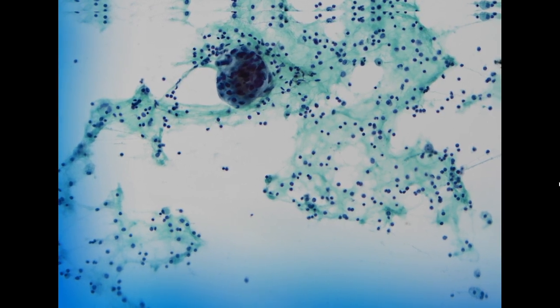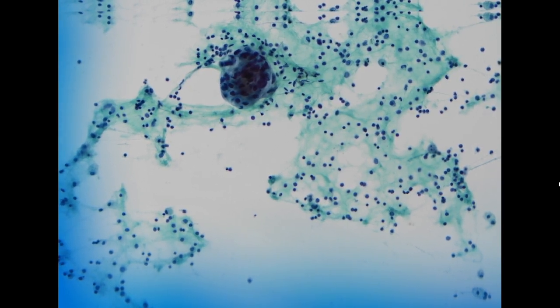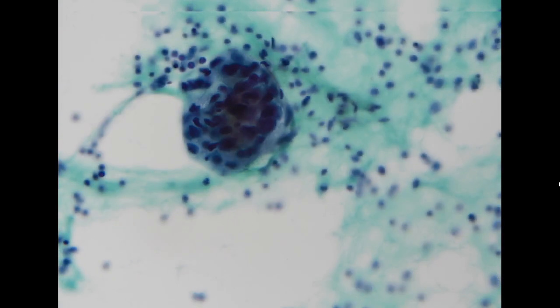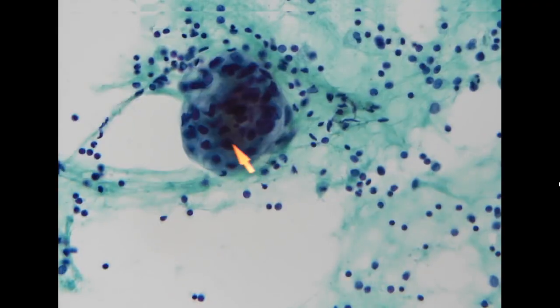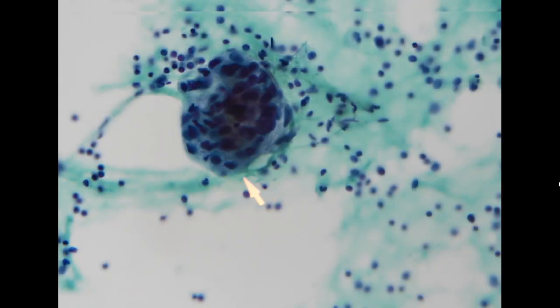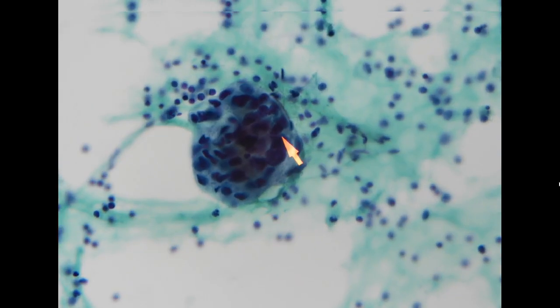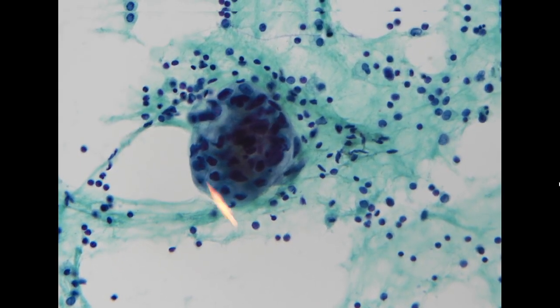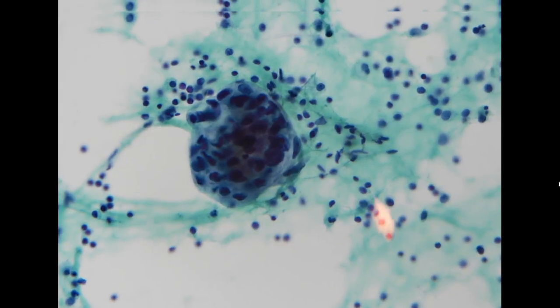Again, in the body fluid specimen, we want to search for tight aggregates as the second population. So here we identify a tight cluster. Most of the cells have hyperchromatic nuclei and are arranged in a very tight three-dimensional cellular cluster. The nuclei are polymorphic, so you can appreciate that each of the cells has a different appearance. So this is consistent with metastatic adenocarcinoma.